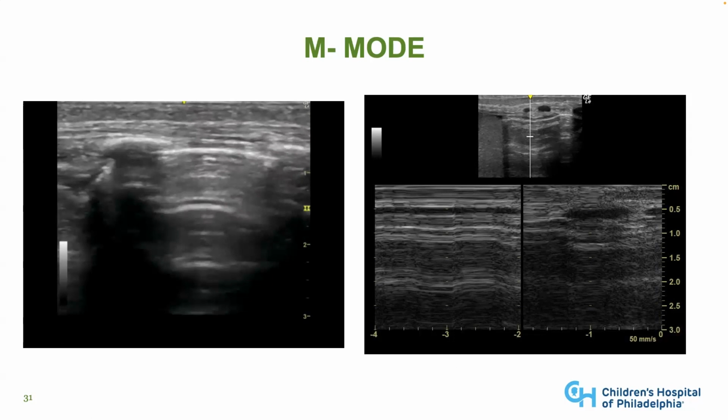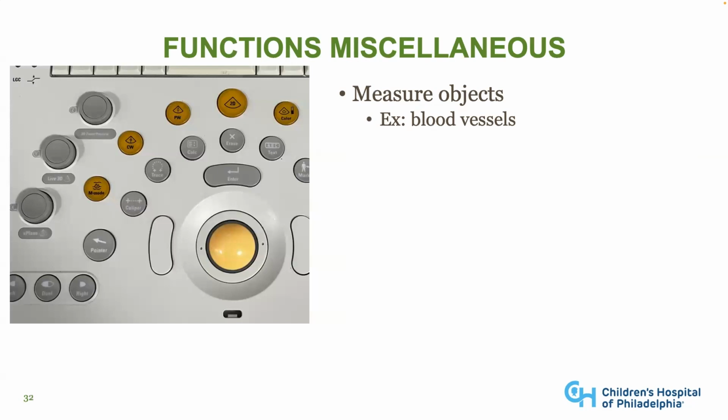And so it's nice for that in terms of telling that barcode seashore sign, whether or not there's any lung slide or not. And it's also really nice to be able to tell some of the IVC variability and some of the valvular motion as well. It also is a way we measure shortening fraction on some of the cardiac images for quantitative assessment.